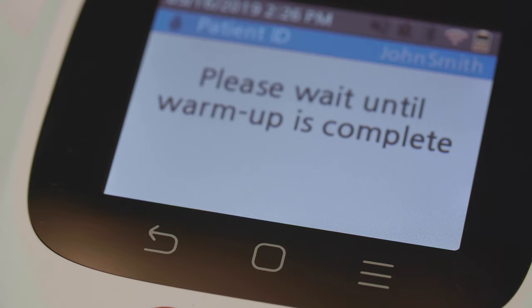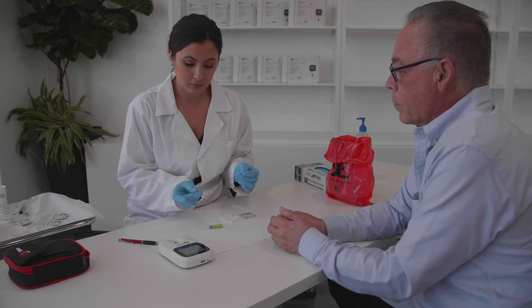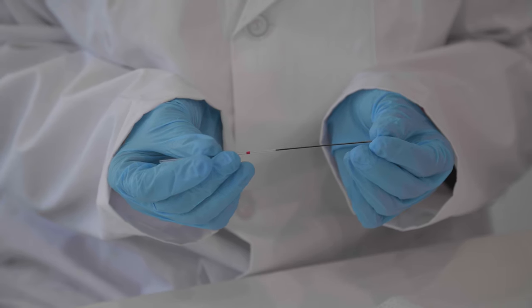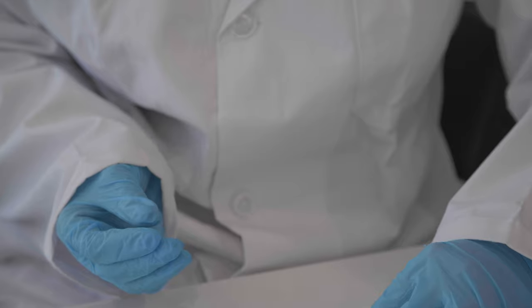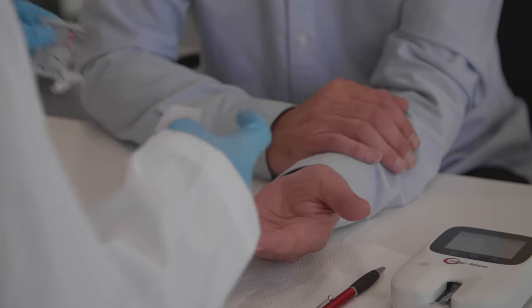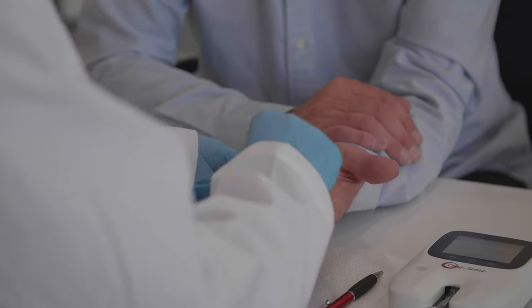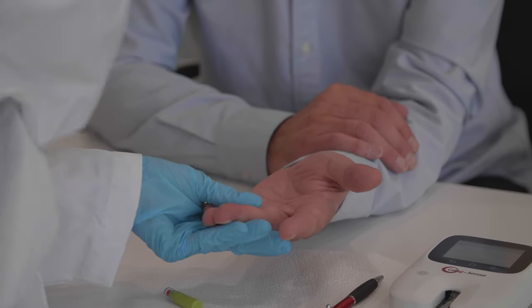The meter will warm up the strip and display a countdown of the time remaining during the warm-up cycle. While the test strip is warming, insert the black plastic plunger into the end of the glass tube with the red strip, using care to avoid hitting the white plug. Clean the patient's fingertip with an alcohol wipe. Dry the fingertip with gauze to remove any excess. Place the patient's hand on a solid surface with the palm of the hand facing up.